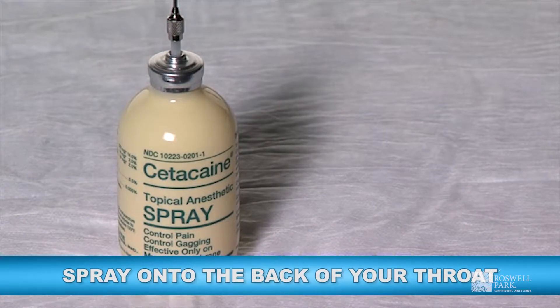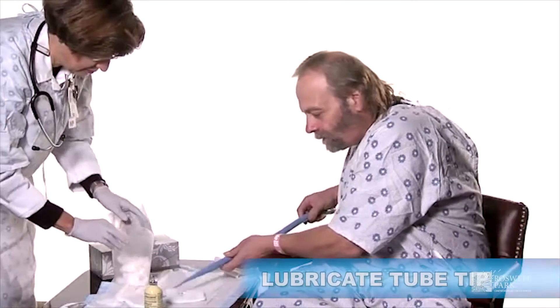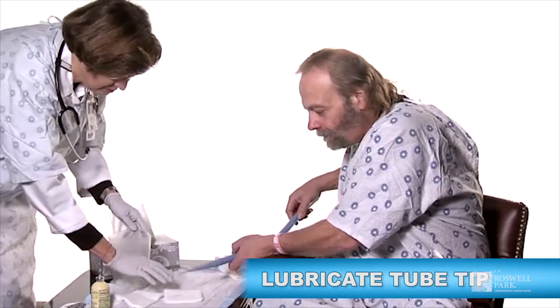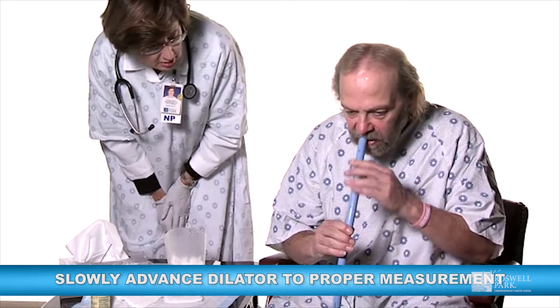Cetacaine spray is used to depress your gag reflex. The tube is lubricated at the tip. Then the dilator is gently placed into your mouth. You will swallow and advance the dilator slowly.